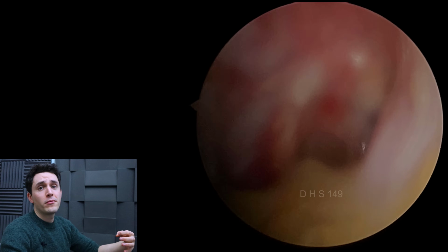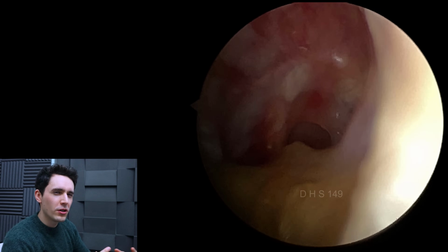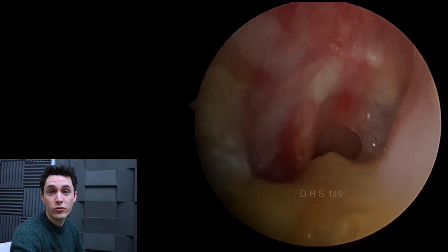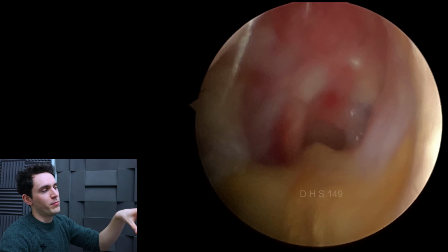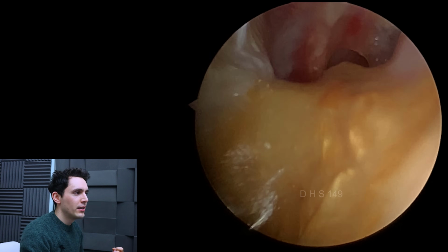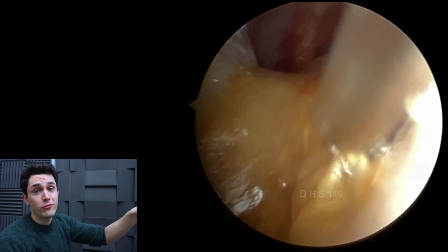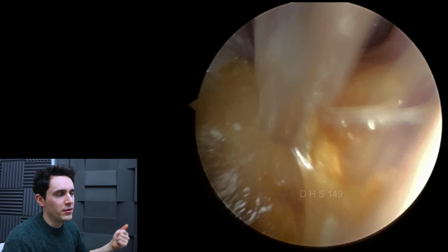This is suppurative otitis media again. Suppurative implying a relationship with pus, which is Latin from supero or superare, meaning pus. To be fair, there's not a huge amount of pus in this ear, but typically when you talk to ear guys, if you use the word suppurative otitis media, that tends to imply a perforation of the eardrum. And you can see back there is a nice big meaty hole in the eardrum.